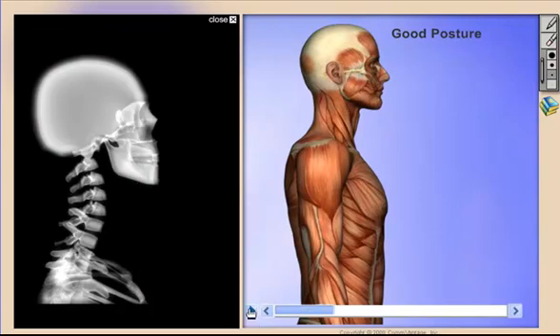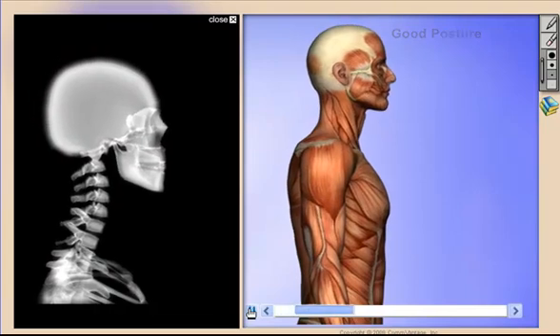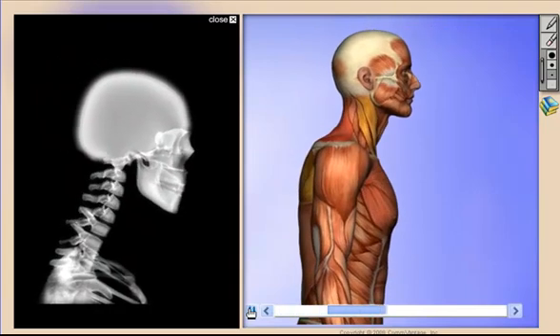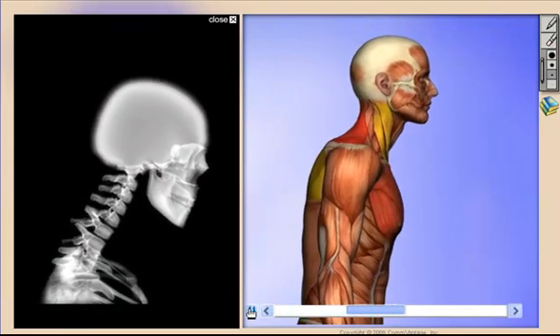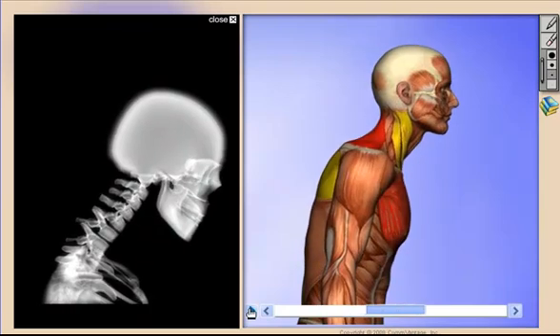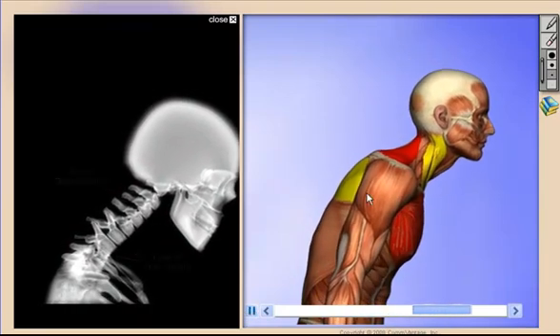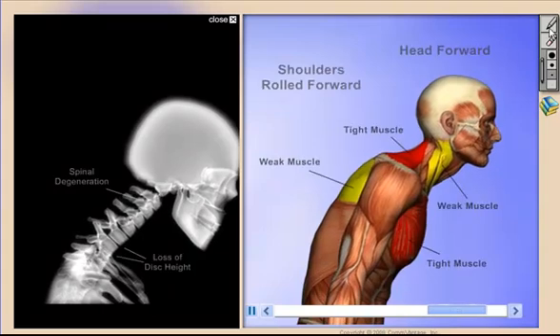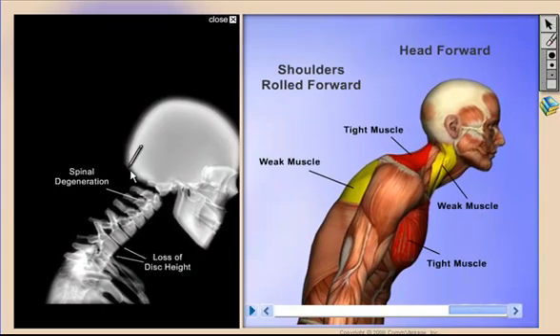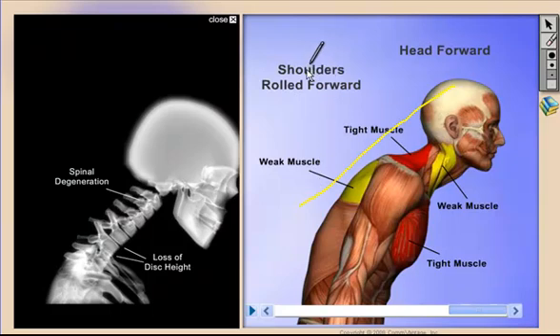Now let's use a posture model in virtual consultation to show the patients where they are today and where they may be headed without the proper care. Keep in mind that there's also a drawing tool here as well, so that's great for emphasizing key points during report of findings, during presentations, workshops, and also during professional meetings.